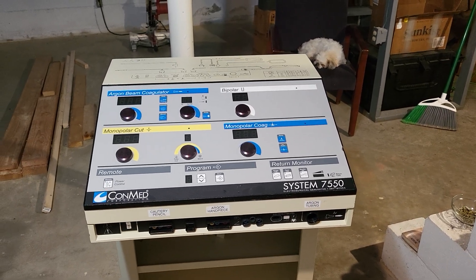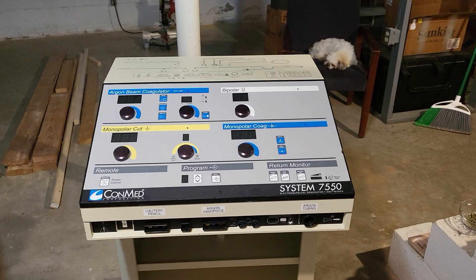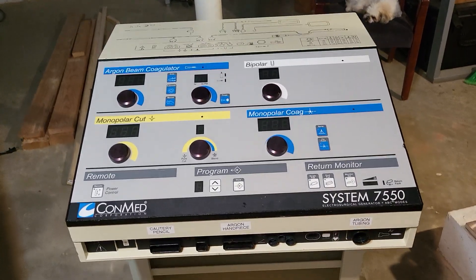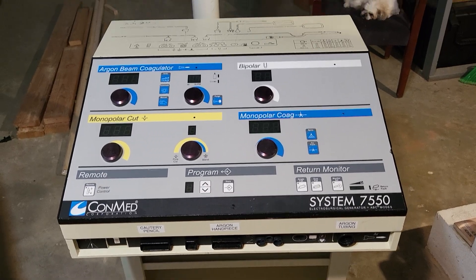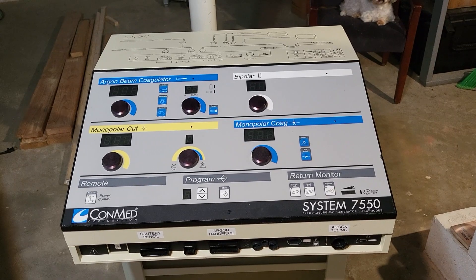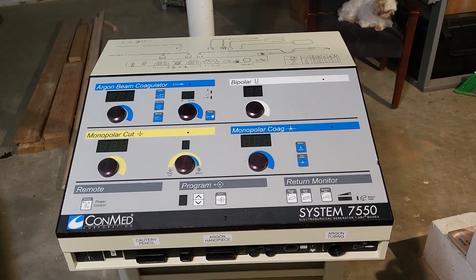Good morning. Today we're looking at the ConMed System 7550. It's an argon beam coagulator, and it also has your standard monopolar cut and coag.